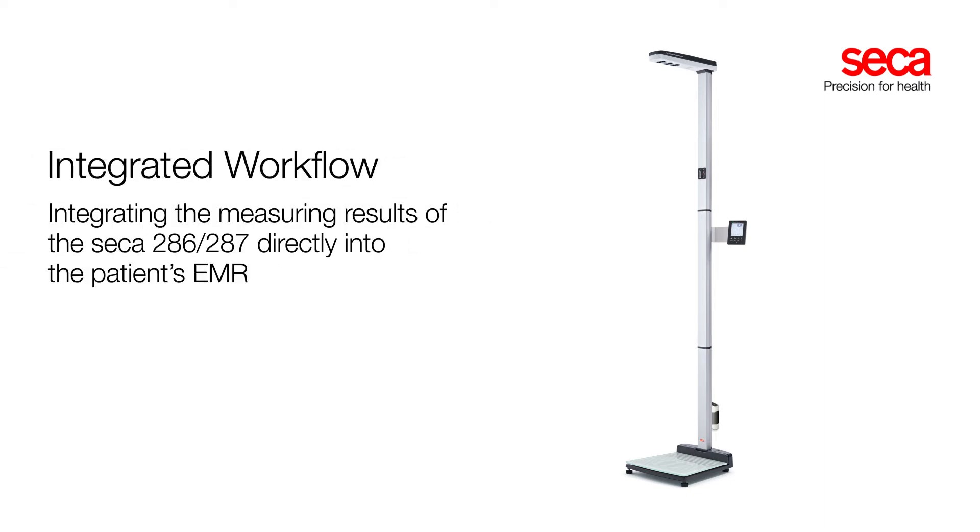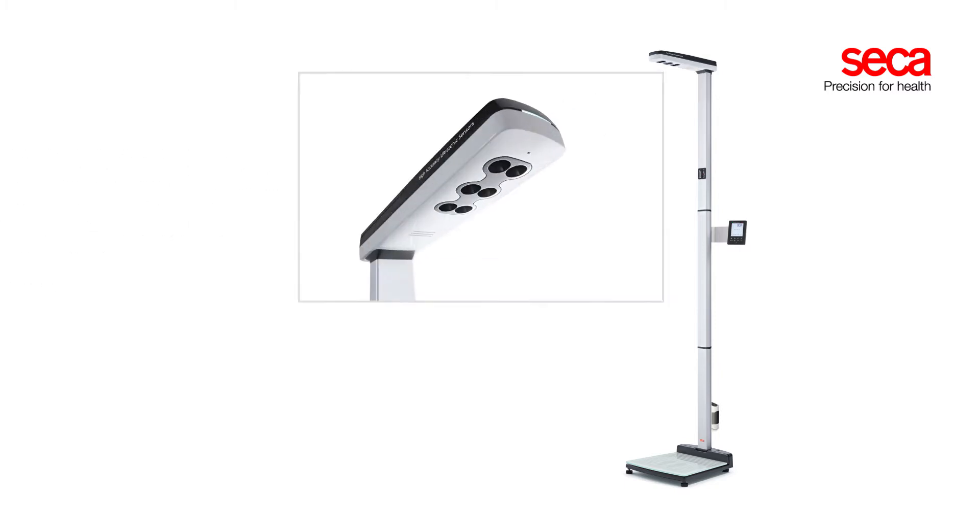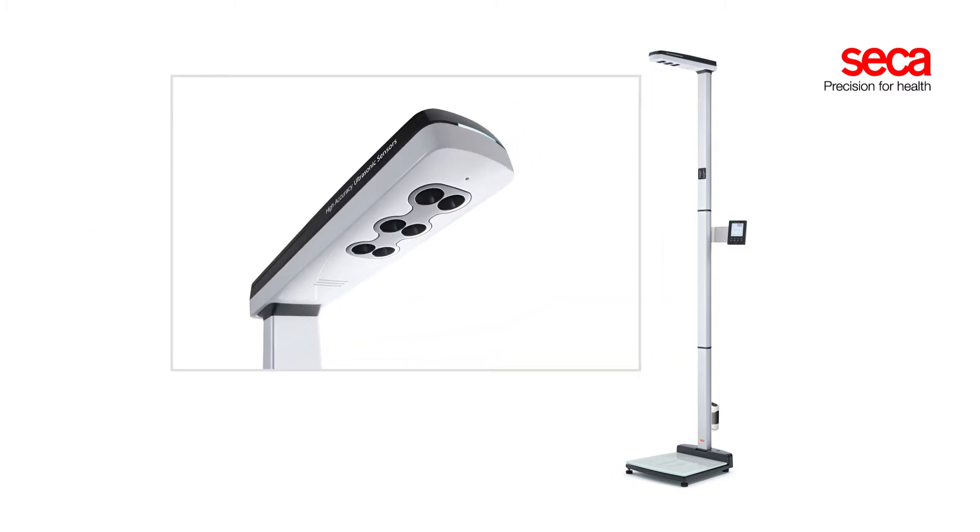The CECA ultrasonic measuring station not only weighs a patient, but also determines the patient's accurate height using three pairs of ultrasonic sensors.